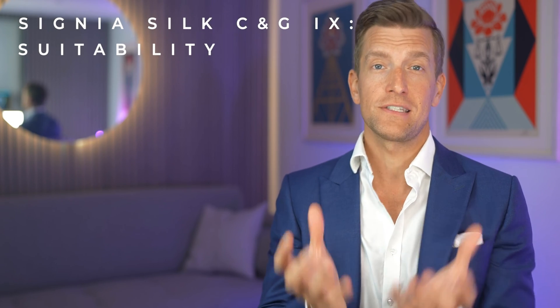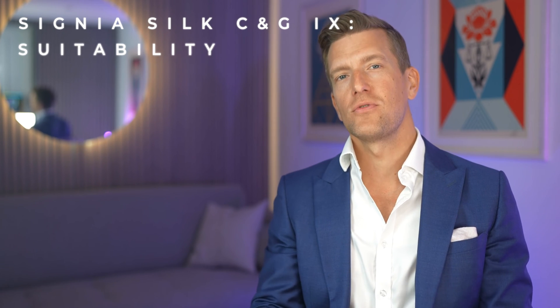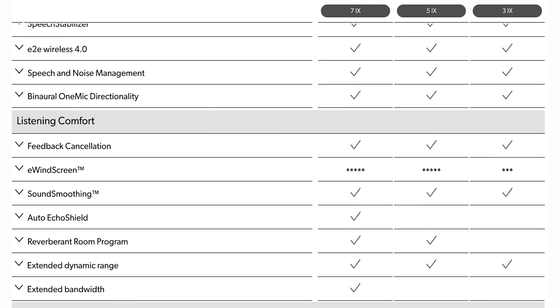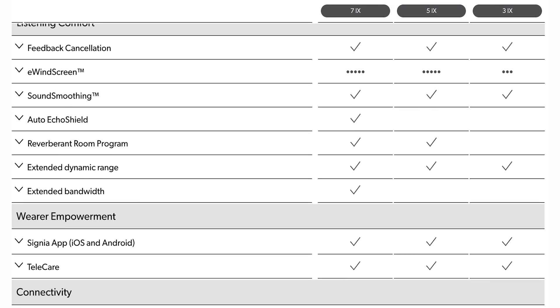The Signia Silk iX isn't suitable for all degrees of hearing loss; however, it does have a pretty broad fitting range, designed for those with a mild to moderate sensorineural hearing loss, and in my opinion could be pushed to compensate for those with a severe hearing loss in some of the higher frequencies. They're available in three different technology levels — the 7iX, 5iX, and 3iX — with the former being the most advanced of the three.